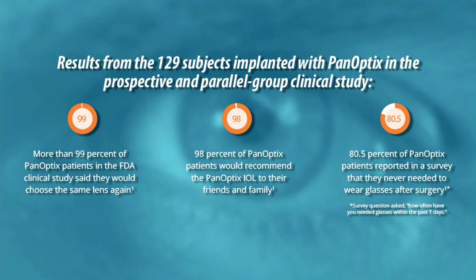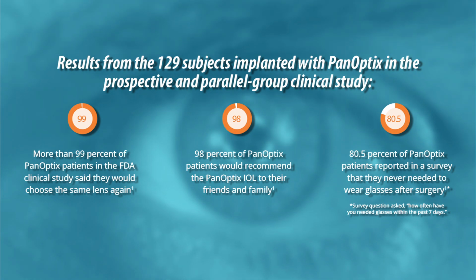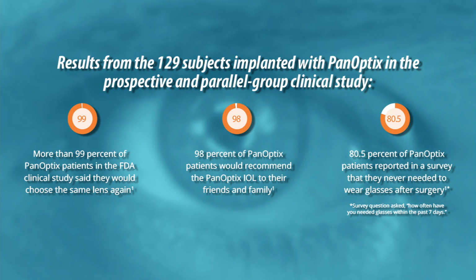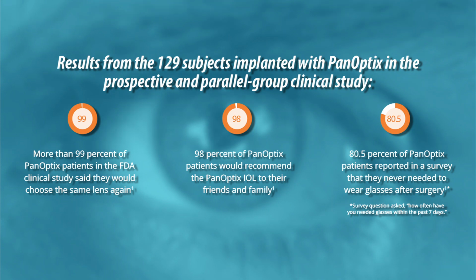It's a matter of the surgeon determining what the best procedure is for the individual. There's no knee-jerk kind of this person gets this and this person gets this. The surgeon has to figure out what the right course is for that patient. But PanOptix certainly would be a choice for those patients who are good candidates for what we would call refractive lens exchange. That's a person whose lens is no longer functioning well. They have a dysfunctional lens, but it hasn't met the level of cataract, but they want to be able to see without glasses, and the most appropriate thing would be a lens replacement as opposed to something like LASIK.